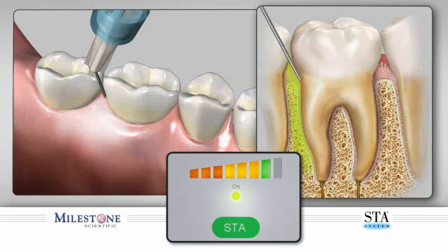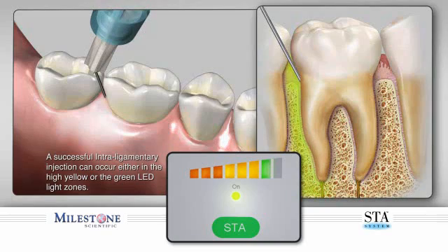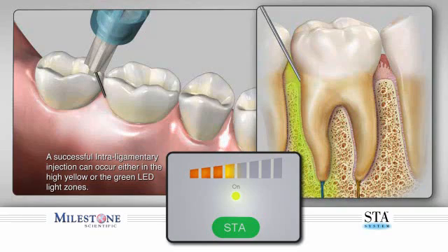Once you feel you are at the base of the sulcus, minimize movement for 10 to 15 seconds as the dynamic pressure sensing technology starts to analyze your position. The visual pressure sensing scale is comprised of a series of orange, yellow, and green LED lights. As the STA system senses pressure building, you will see the sequential illumination of LED lights on the front of the unit.